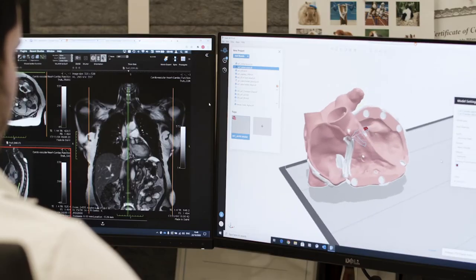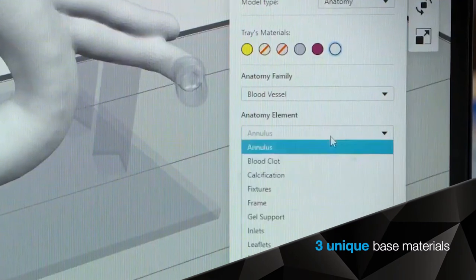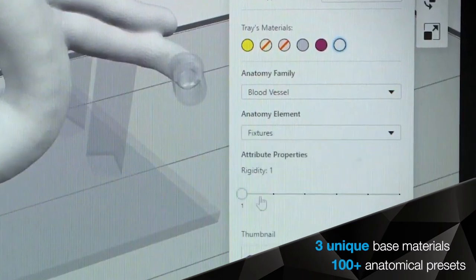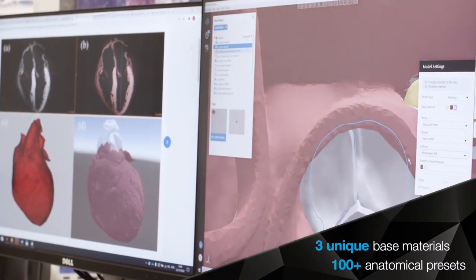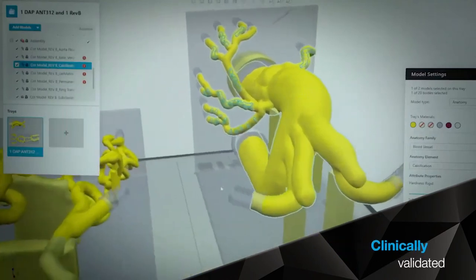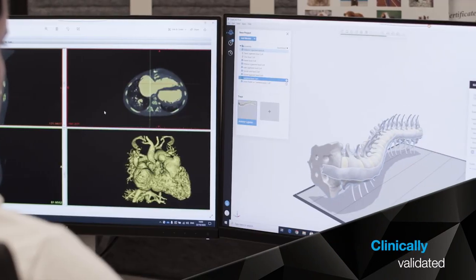The digital anatomy printer software has a preset anatomy menu with more than 100 options that allow you to print accurate, lifelike models in a few clicks by simply choosing the desired anatomy.